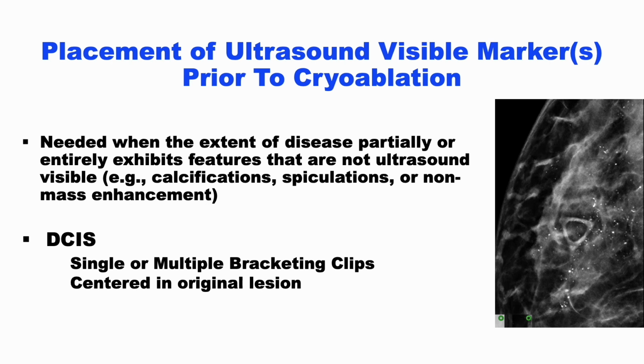So even though the tumor might not be visible any longer, placement of an ultrasound-visible marker can help to identify it for cryoablation. This point should be clear.